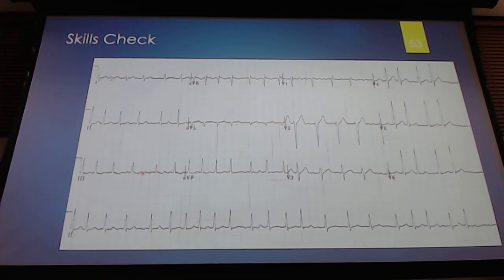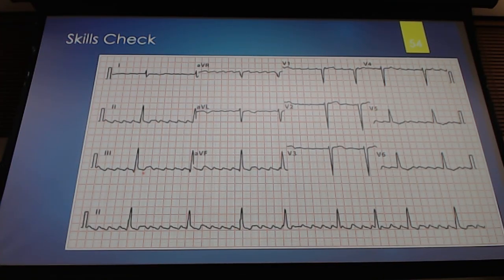Sometimes you look at the ECG and you're like, oh, that's totally atrial fibrillation. Other times, on multiple occasions, not just with me but the docs I work with too, we're like, shoot, is this AFib? Let's try to slow this down and see if we can see those fibrillatory waves, or those flutter waves. So this is atrial fibrillation, okay?